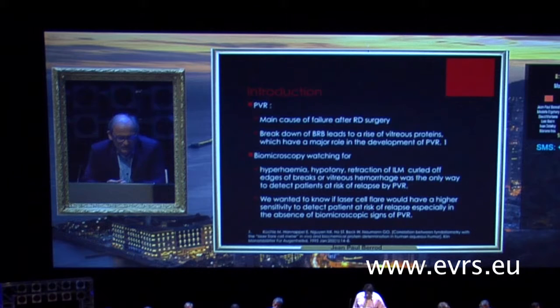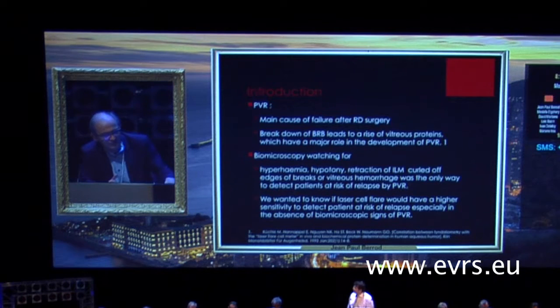So we wanted to know if laser cell flare would have a higher sensitivity to detect patients at risk of relapse, especially in the absence of biomicroscopic signs of PVR.